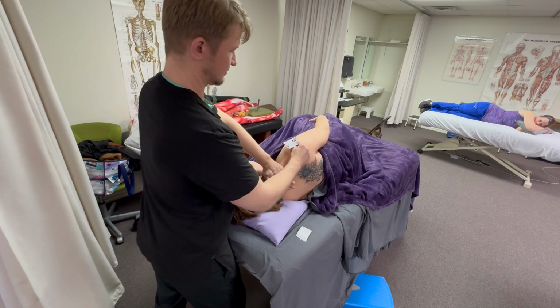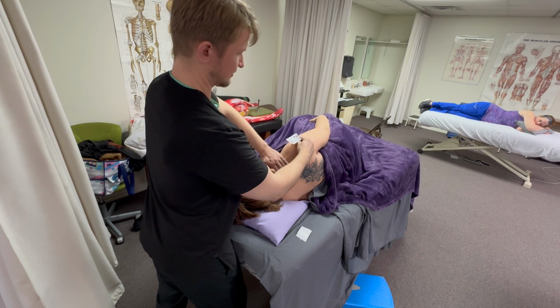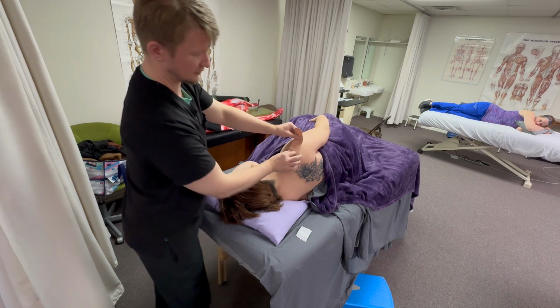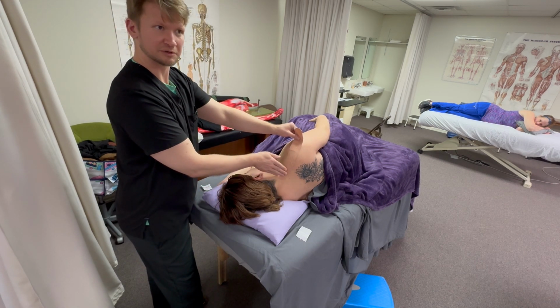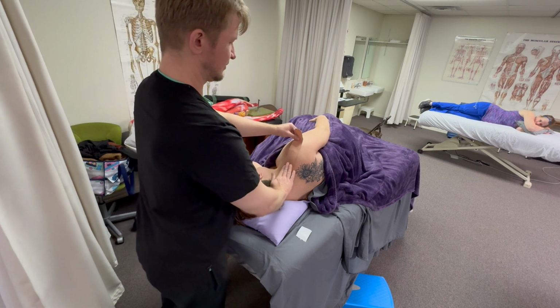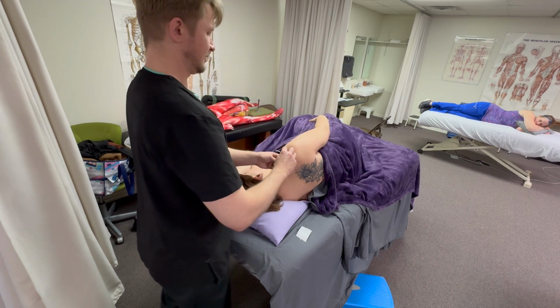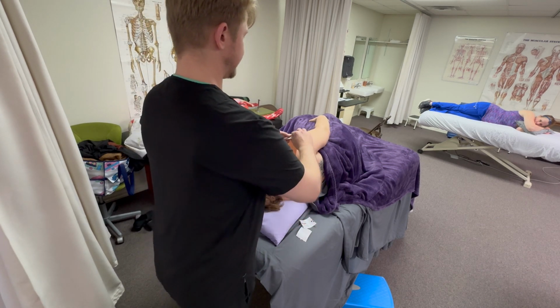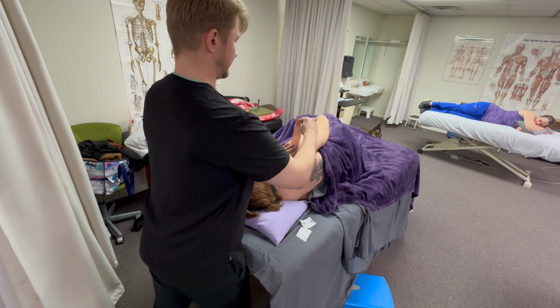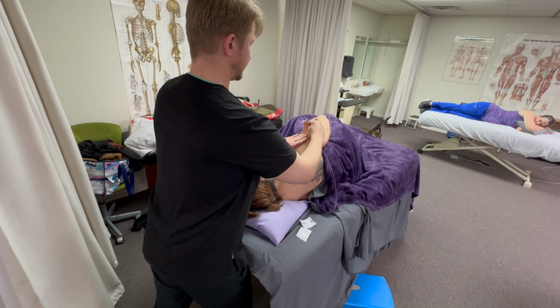Stretch. Here. Very small swoop, very small arc. Then gonna take this one off. And now I'm really thinking deltoid. And we'll see if this one goes far enough. I think we'll be just about right.